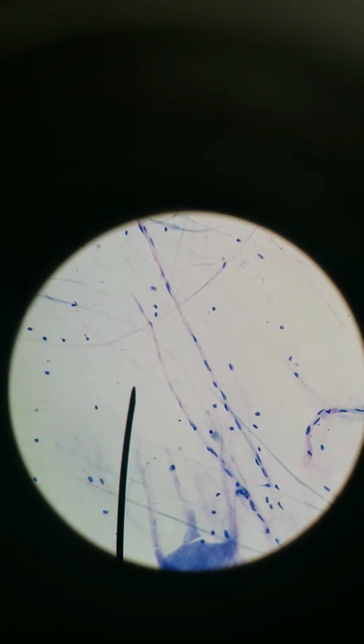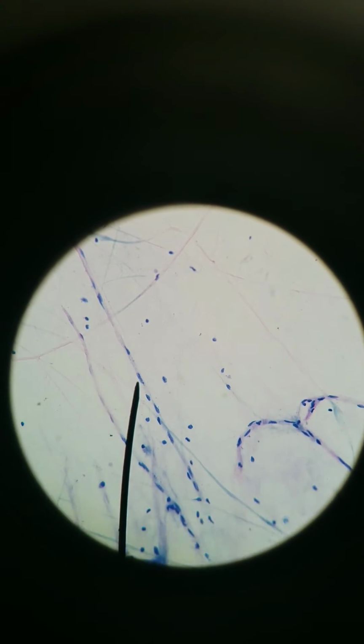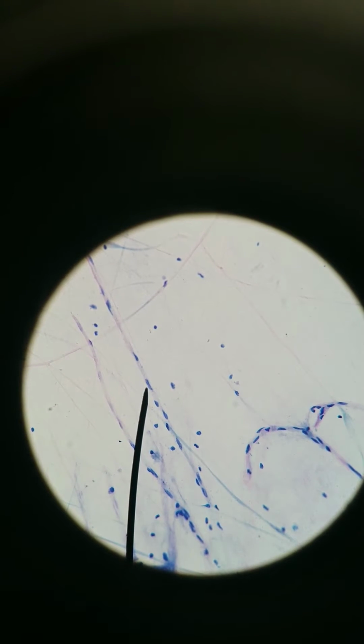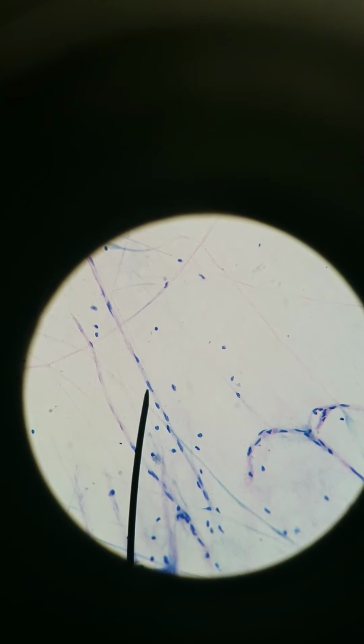These are myelinated axons, and remember myelin covers up the axons of cells, creates those myelin sheaths. They're created by one of 2 cell types. In the central nervous system, they are oligodendrocytes, and in the peripheral nervous system, they're Schwann cells.